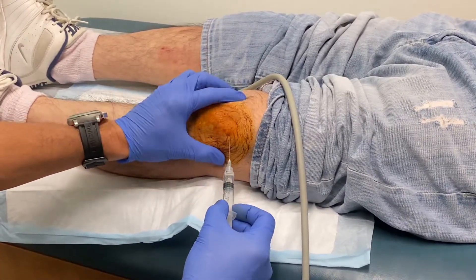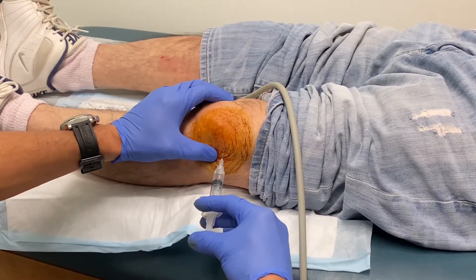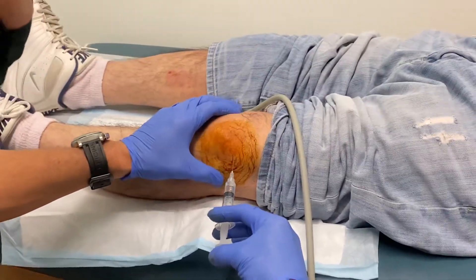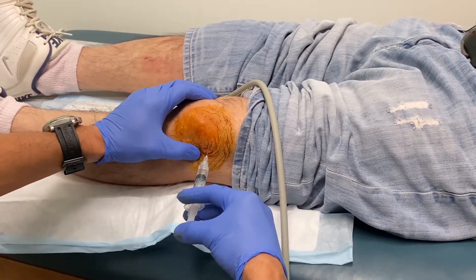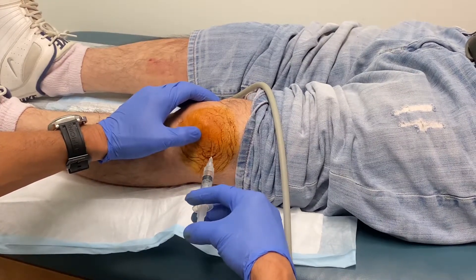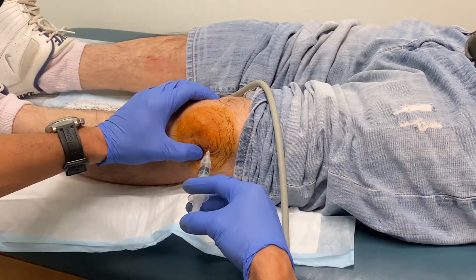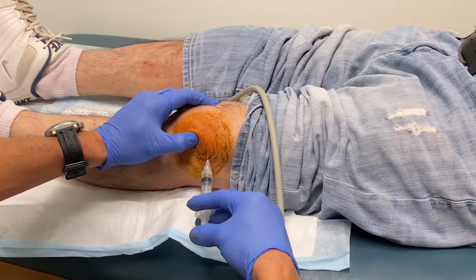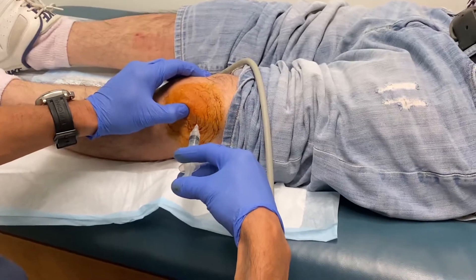Un piquete chiquito — you're going to feel a little bit of burning. That medication burns sometimes. And then I'll be getting a 22-gauge needle. So I'm injecting my lidocaine right now, right below the kneecap, going through the skin and the subcutaneous tissue. I'm really not going into the joint. The goal is to not inject lidocaine into the joint. A little burning — lo siento mucho.